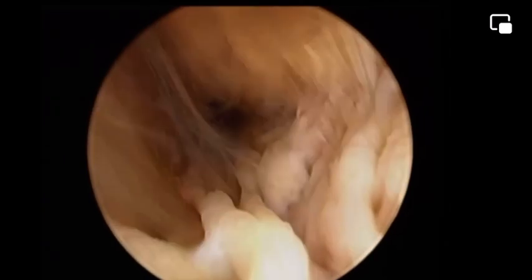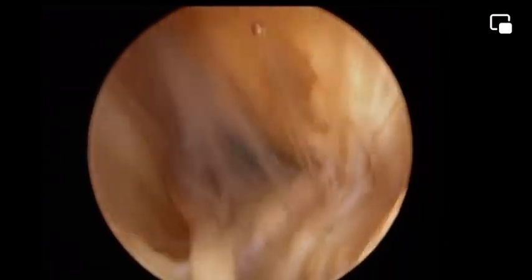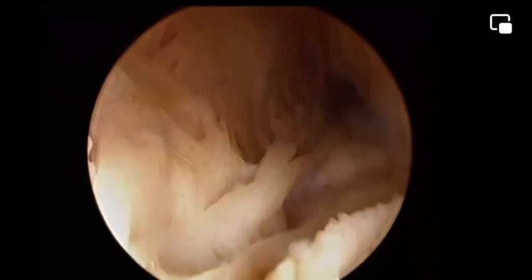It's very obvious here. You see here, I'm spending much more time in the cervical canal before entering the cavity, and using, as I said, the force of fluid jet to squeeze the mucus out and clean the cervical canal. So slowly we do this procedure. Take it maybe a few minutes, like I'm doing here. The cervical mucus looks like threads. It's very viscid, and it might cover the lens and you go into a wrong direction.